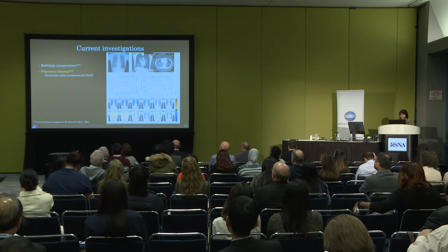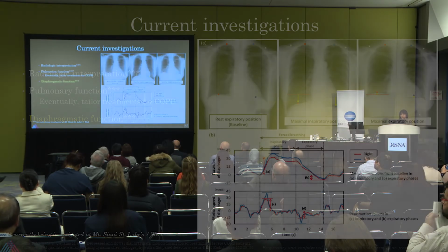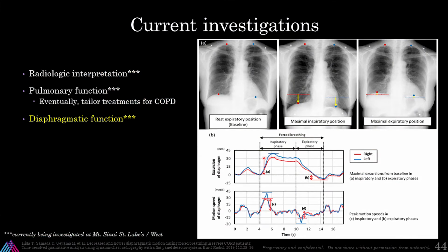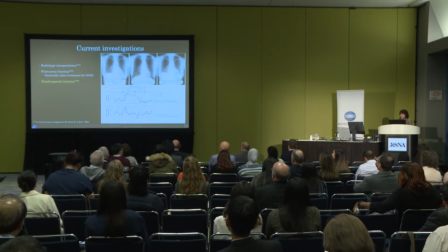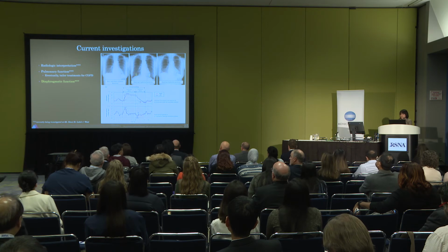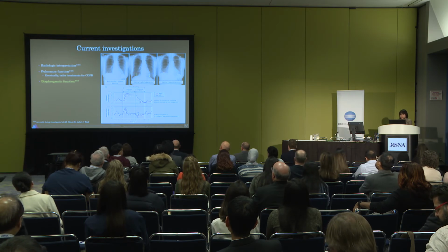And that's really huge. The next thing obviously is diaphragmatic function. Again, this is another aspect of reevaluating the sniff test and seeing whether or not diaphragmatic motion, for example, with neurological disorders, might impact diagnosis.